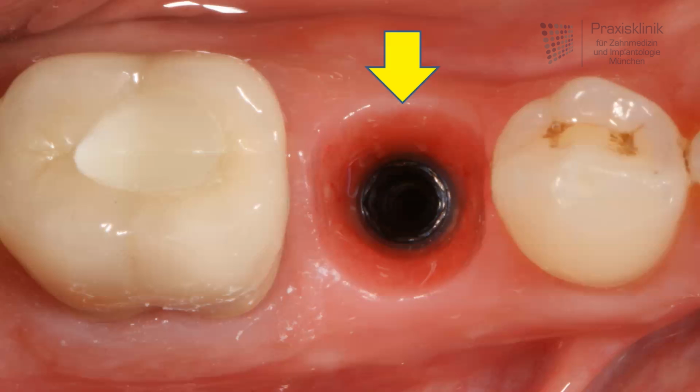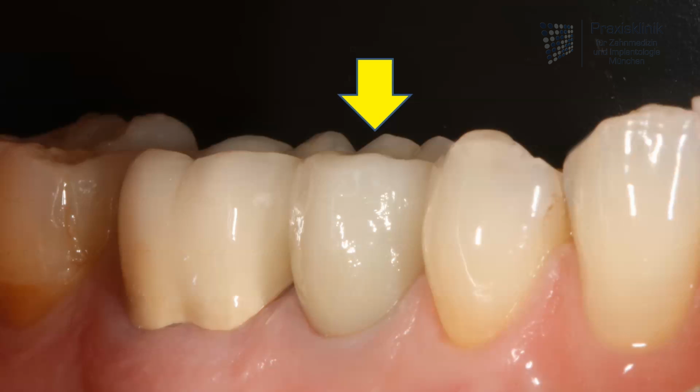So in this situation, we can take the impression, take the color, send it to the technician, and he can produce the final crown. You can see the implant body itself is not a full titanium body. It's empty or hollow inside, so you can screw something in. And you can see in here the final crown indicated again by the small yellow arrow.